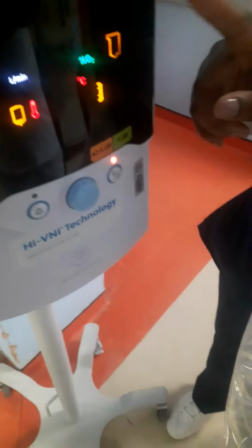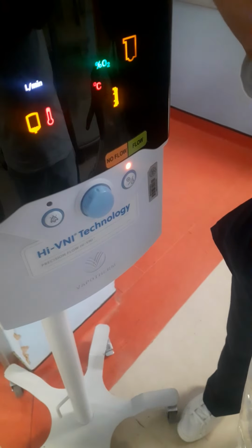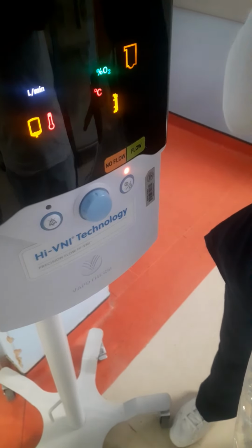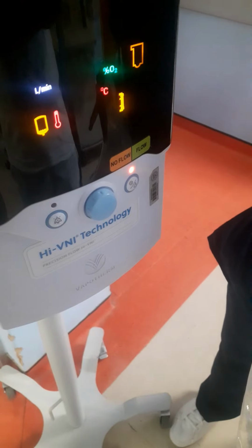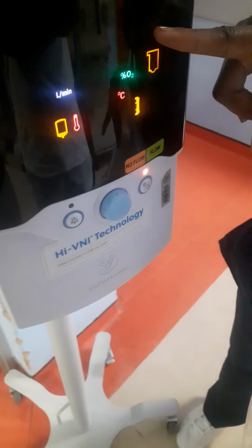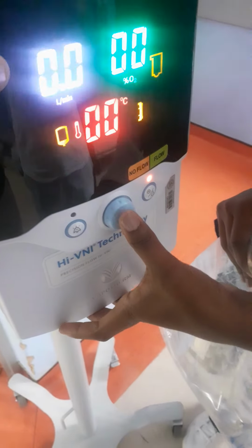As I said, we start at 100%, and remember that oxygen is toxic, so we have to monitor. If the patient is having stats of above 90, above 95, we wind down the oxygen because it's also a medicine. You guys know that. And this one is our flow.